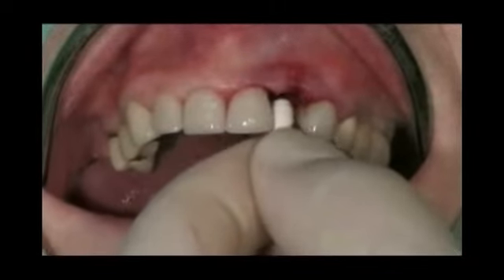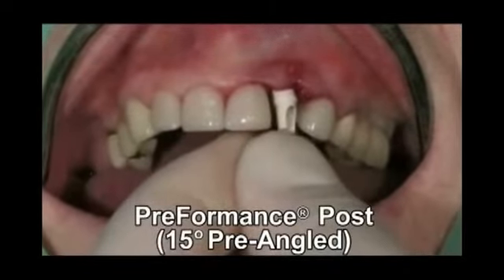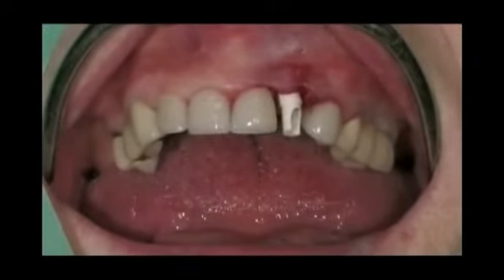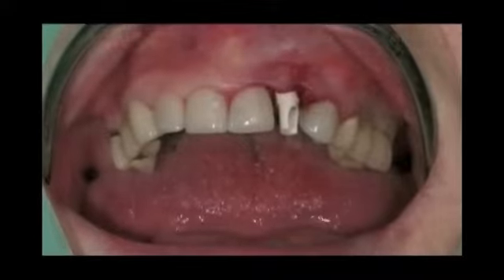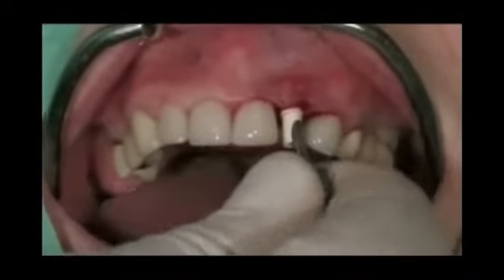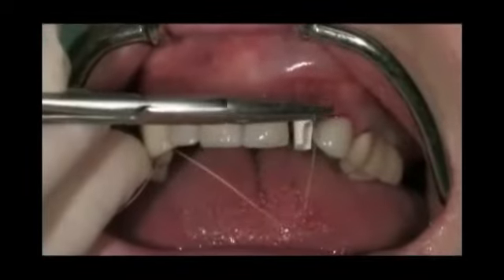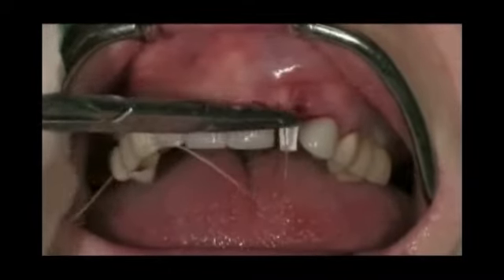An appropriate sized PreFormance post was selected for use as an interim abutment. The selected post had a 4 mm collar height with a 15-degree angle correction. It was placed into the internal interface of the implant with visual confirmation of complete seating. A laboratory abutment screw was placed to retain the post. The PreFormance post was prepared intraorally with a diamond burr for adequate interocclusal clearance, optimal retention, and resistance form, as well as preparation of the finish line at the gingival margin. Interrupted sutures with a 4/0 Vicryl were placed to close the soft tissue flap.